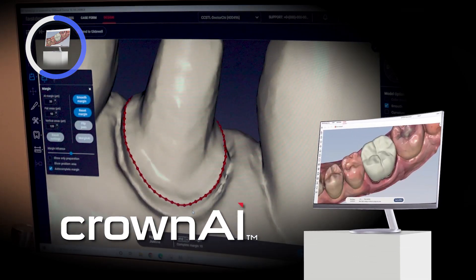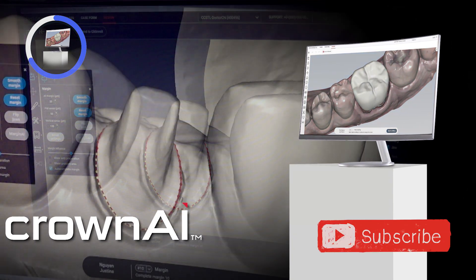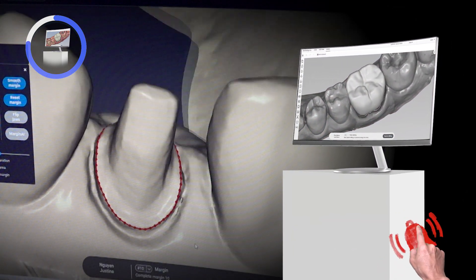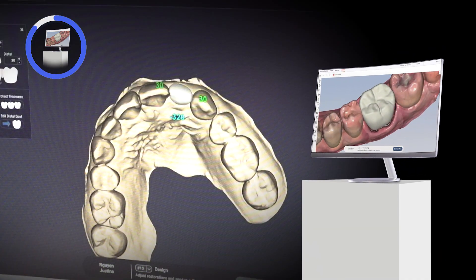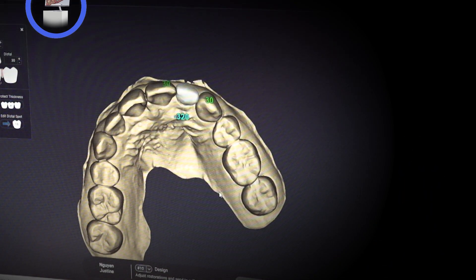Artificial intelligence identifies the margin instantly as shown by the dotted red line. I checked it and marked my final margins, making sure to view it from various different perspectives. I received a BioTempsNow crown proposal with just a few clicks and made minor adjustments to dial in my contact parameters.